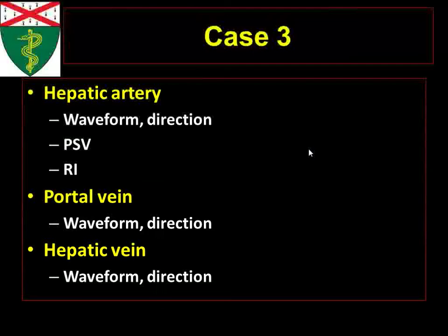Which direction do you want the portal vein to go to? Hepatopetal as well, right? Towards the liver. And if you ever get confused with hepatopetal and hepatofugal, in my reports, I just say the portal vein flows towards the liver. The hepatic veins flow away from the liver. And I borrowed that from Dr. Scout, who's very smart.